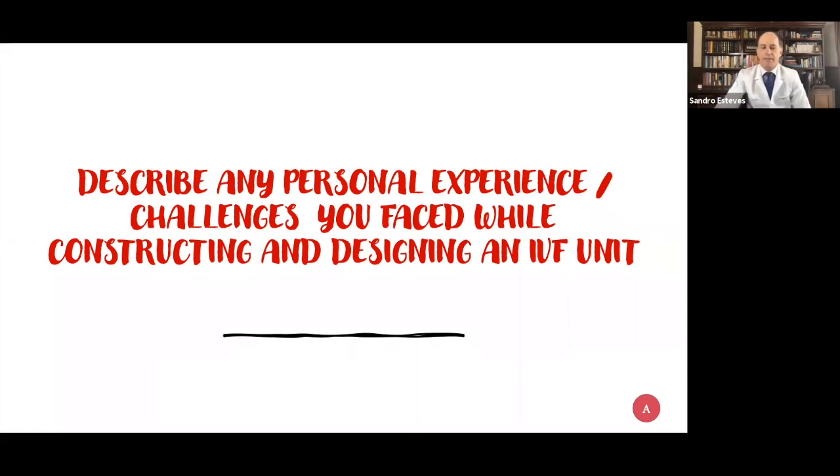The second point would be try to be the technical expert in air quality control. Do not rely on what the companies are telling you. Don't take it for granted, because most of these companies are very well versed in industrial clean rooms, and not completely aware of our needs in the IVF community. So try to learn and bring the technical expert in when you are designing your lab. I think it's going to be very, very important.